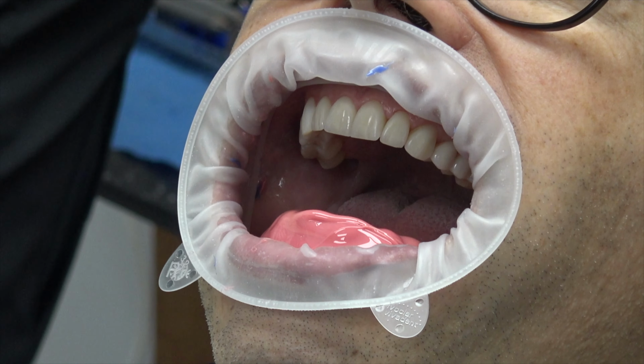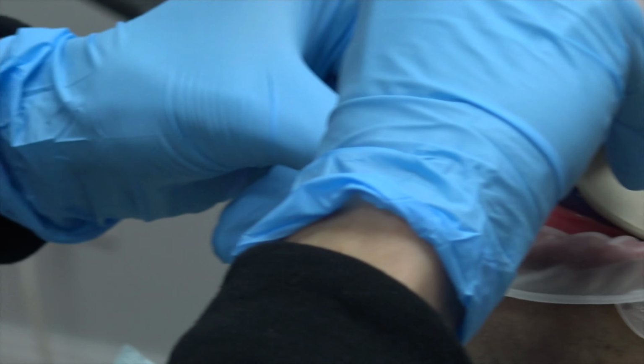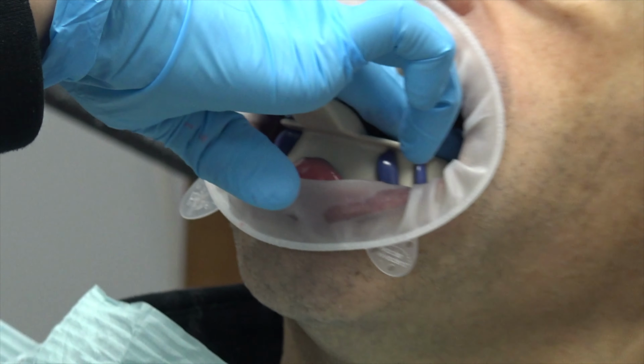It would probably pull them off. Even the soft version of Impregum will pull off provisionals in some cases, but for the most part, it doesn't. So we plan it out so that at the restorative records appointment, frequently I want to take off the posterior provisionals anyway. Once we're satisfied with everything with the provisionals, we take an Impregum impression, and if the posterior provisionals come off, no big deal. I was going to take them off anyway to do the bite records. So that's the sequence that we follow.